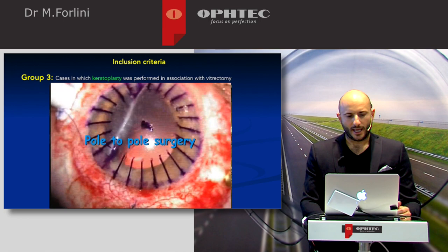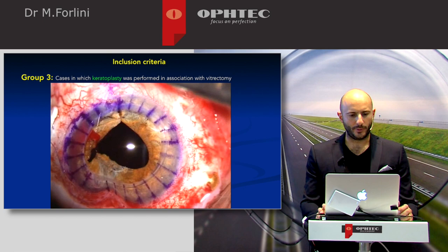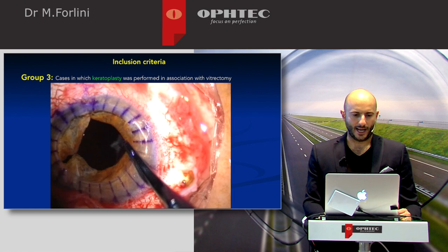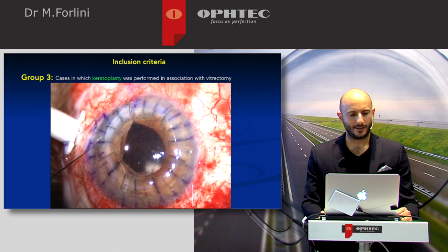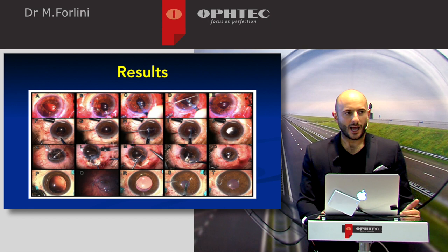Another case: corneal trephination, open-sky approach again. Iris suturing to obtain a better pupil, followed by iris-claw implantation in open-sky — with open-sky it is even faster and easier. After iris-claw implantation, the final corneal graft was positioned. Suturing of the iris to obtain a better pupil completed the procedure, with a good final result.